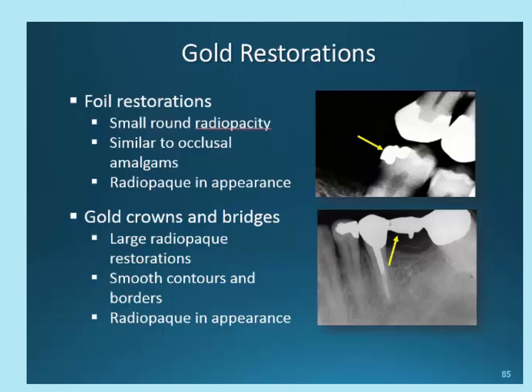We can see that there is no residual type of material used around this bridge. And most likely this is an entirely gold crown and gold bridge. The entire tooth is covered in restorative material, and again, this is most likely a complete gold crown.